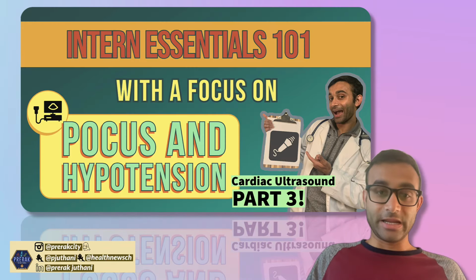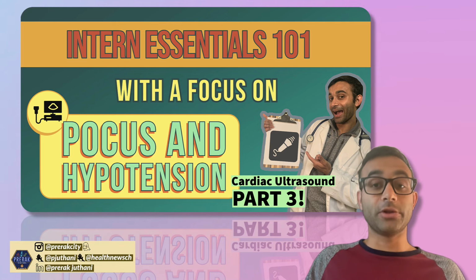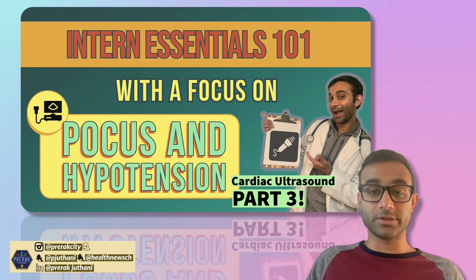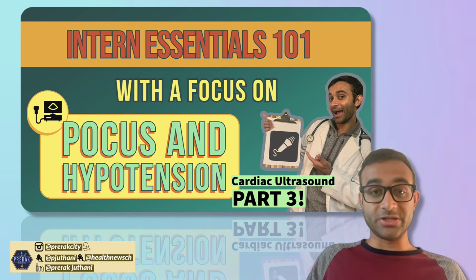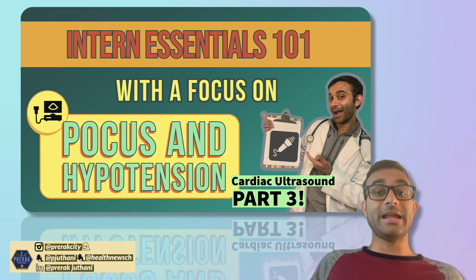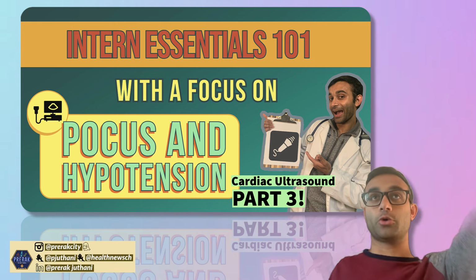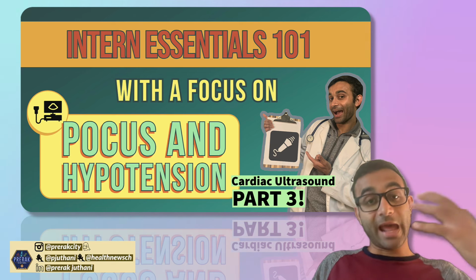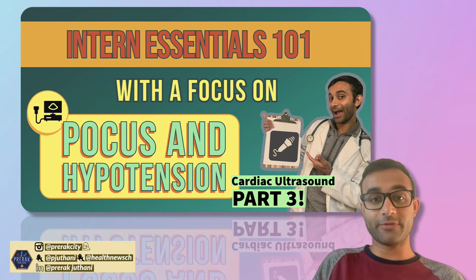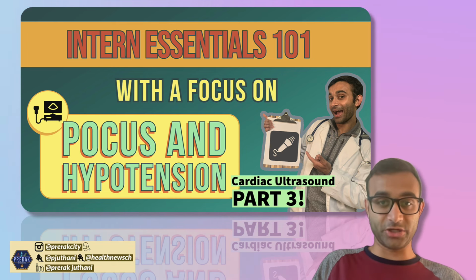Today's video is part 3, and I think it is the most relevant when you have a patient with hypotension, because this view will allow you to look at the heart and also look at the main vessels that lead to the heart. Specifically, I'm talking about the inferior vena cava, and the reason why it is very important is that every single drop of blood that eventually gets propagated out to your body, brain, and even your lungs has to go through it. What that means is most of the preload comes through the inferior vena cava, and it also comes through the superior vena cava. As long as you can see both of them joining into the right atrium, you'll get a very good idea of just how much fluid a patient can have on board.